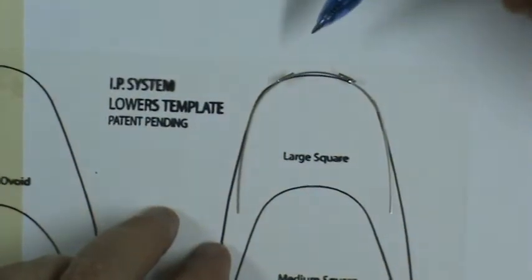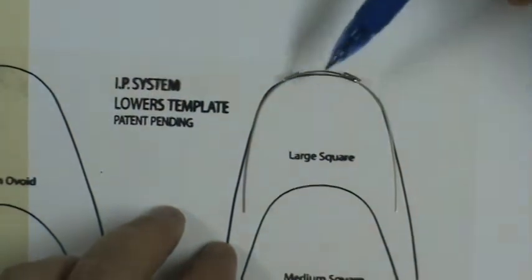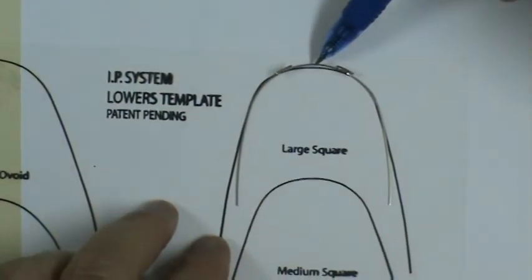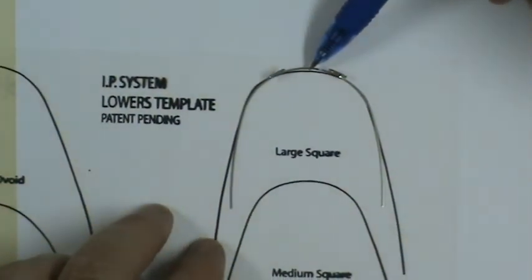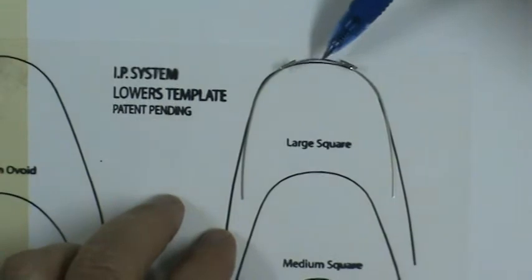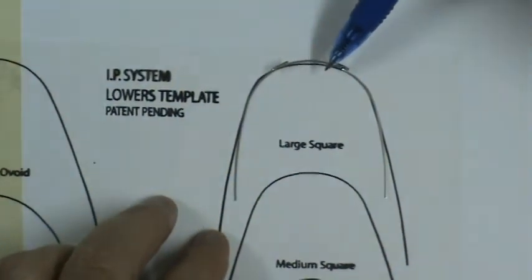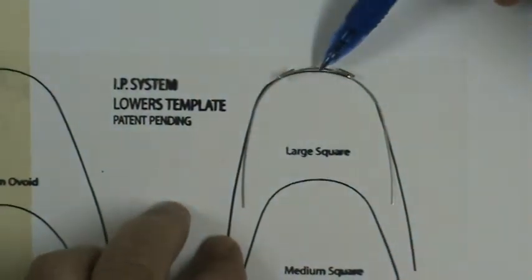Okay, we're going to make a lower large square, and for this, because the anterior is so wide, we're going to start with a non-extraction ovoid number 1. Any loop size that you have chosen for the lower, it should be loop size anywhere from 22 to 28, maybe as much as 30.